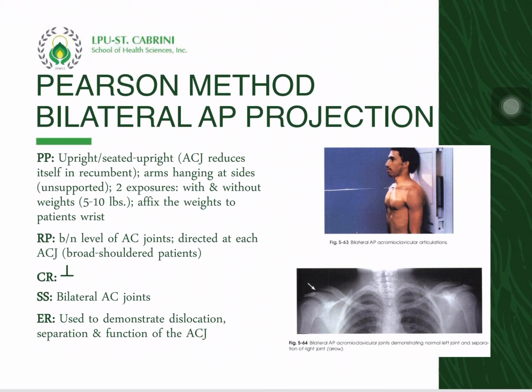The central ray is directed perpendicular, entering a point between the level of the ACJ. So Pearson method is used to demonstrate dislocation, separation, and function of the acromioclavicular joint.